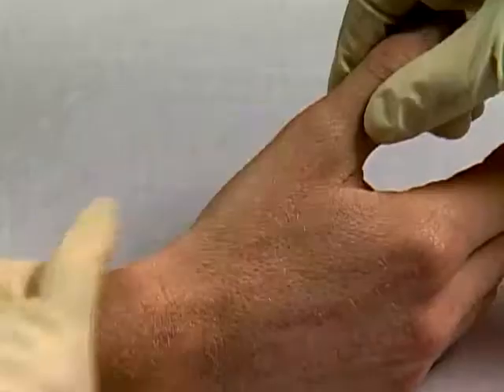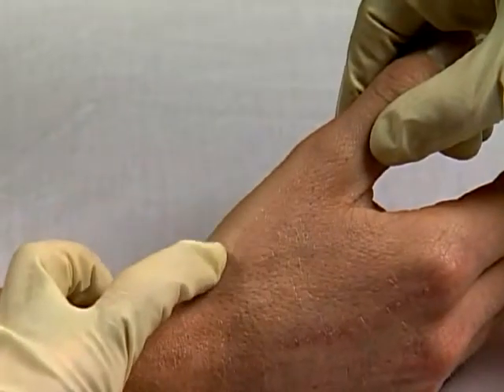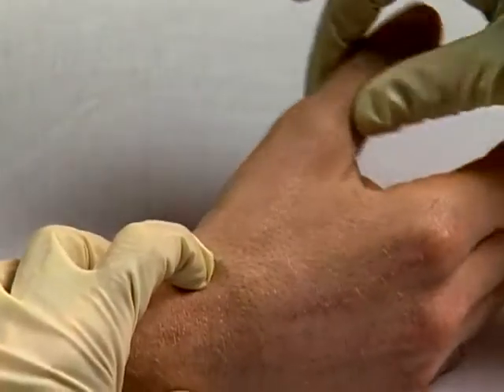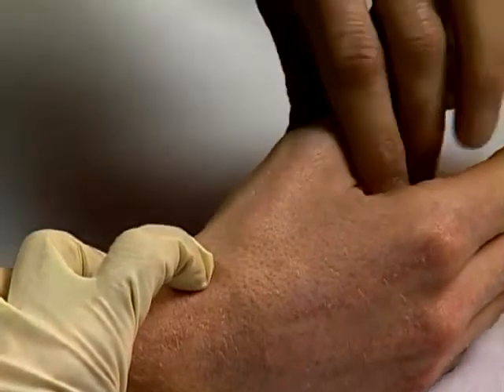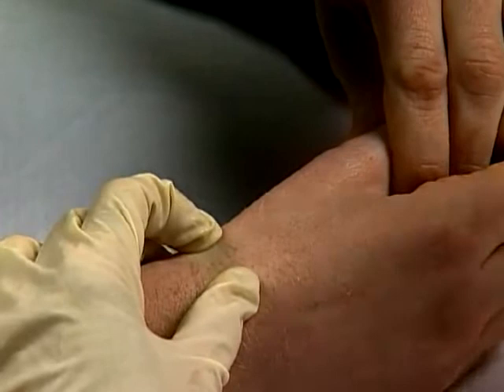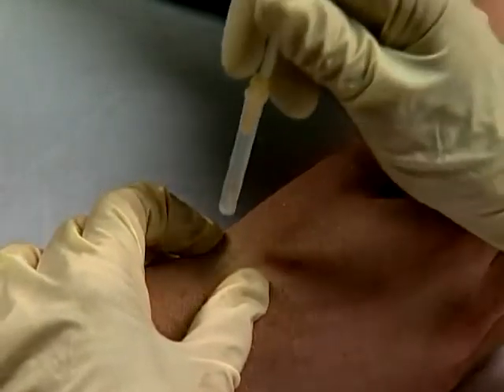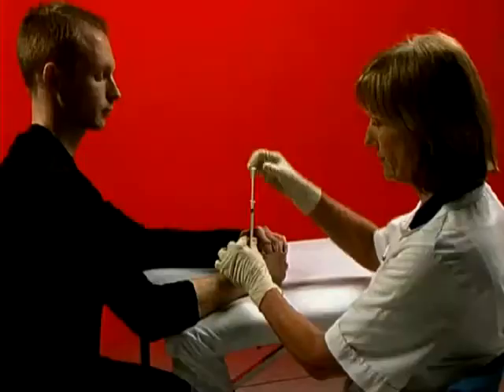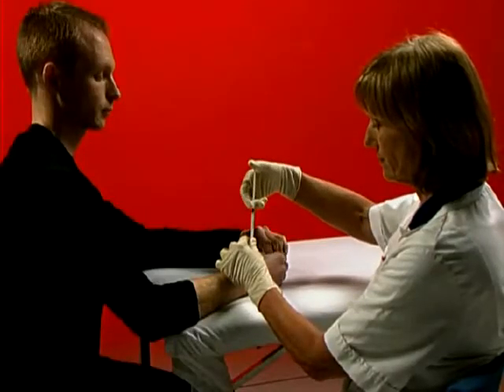Identify the gap at the base of the first metacarpal, which is at the apex of the snuff box, by opening and closing the joint. The patient extends the thumb. Mark entry point, clean and firmly stretch skin, and rapidly insert needle perpendicularly into joint space. Aspirate and inject as a bolus.